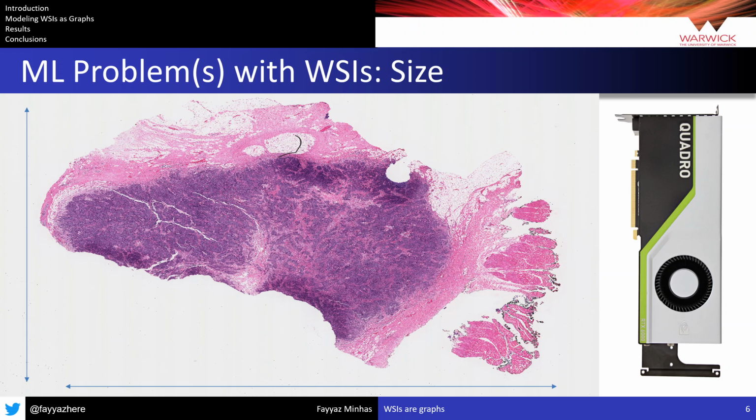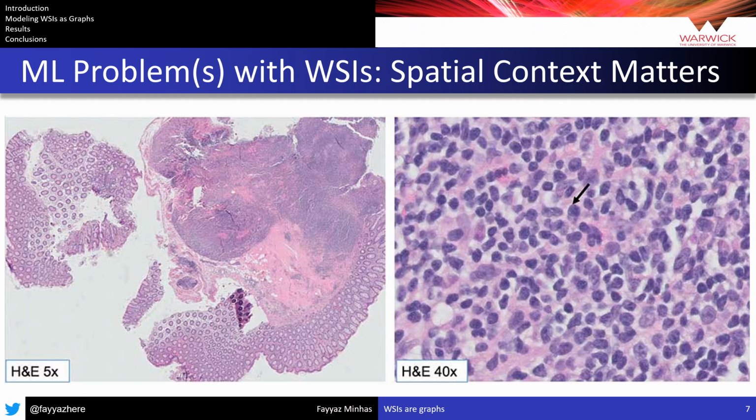Similarly, as I said earlier, these whole slide images are pretty large, and that presents unique technical challenges as well as machine learning challenges on how these solutions are developed. Typically, neural networks are run on GPUs, which have a limited memory. So fitting a large number of images and then trying to learn over those images may not always be possible. So we need better GPUs with more memory. That's something for the excellent GPU vendors to consider. However, it also presents a set of unique machine learning challenges that I'll talk about in just a minute.